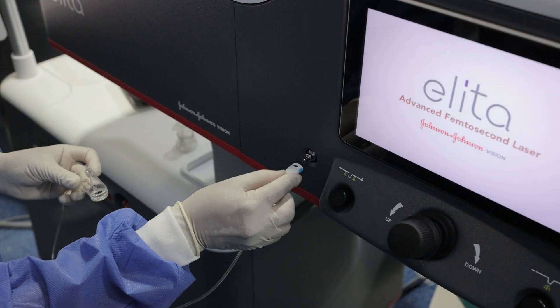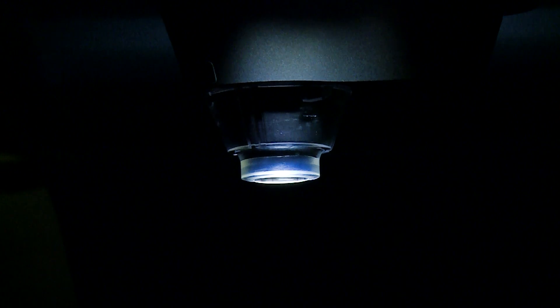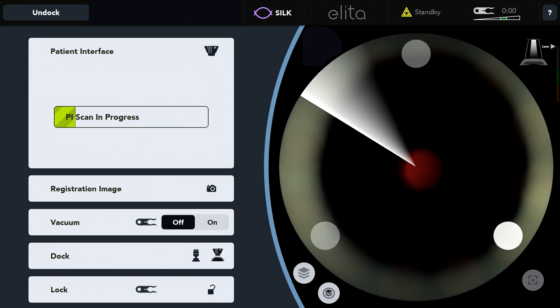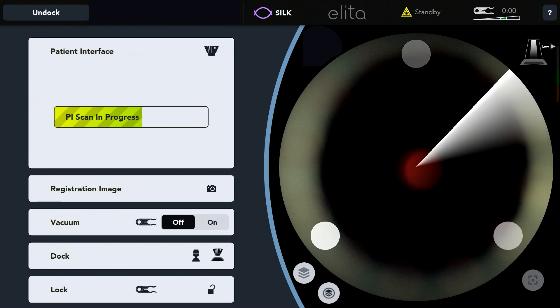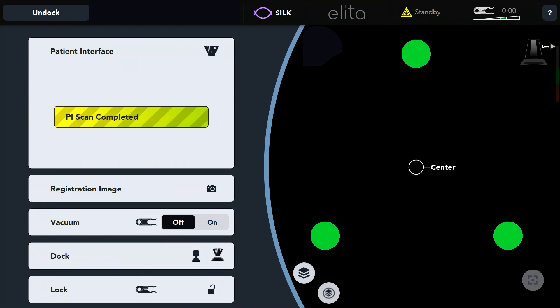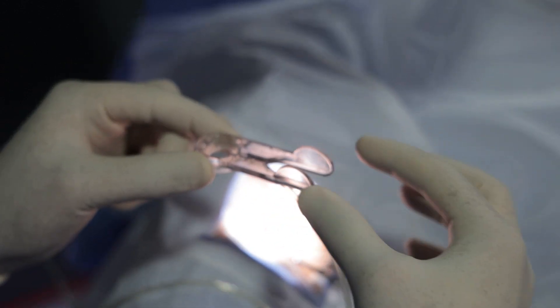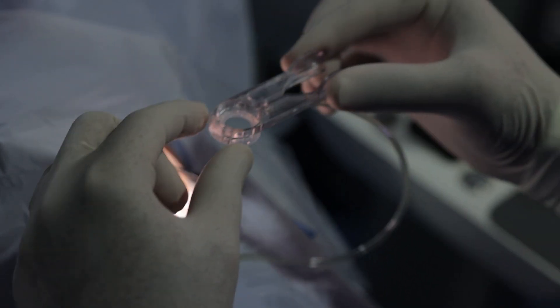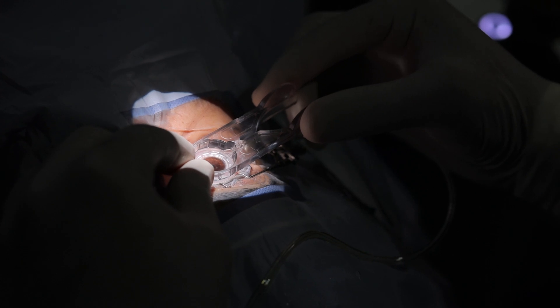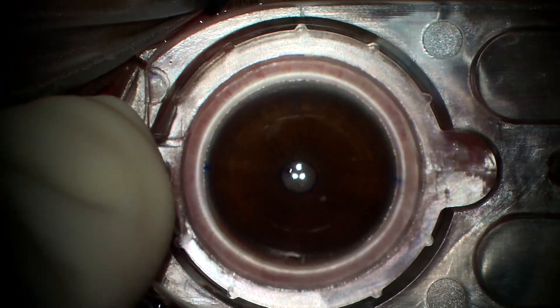We first connect the suction apparatus. Then the patient interface cone is rotated and placed in the socket. We need to look at the PI scan, which scans 360 degrees of the interface to look for any sub-micron deficiencies which might hinder the suction and subsequent laser from creating a flap or a lenticule. I hold the suction apparatus between my thumb and index finger. It's important that I place it gently, watching for scleral show and whether or not it's equal on all sides.